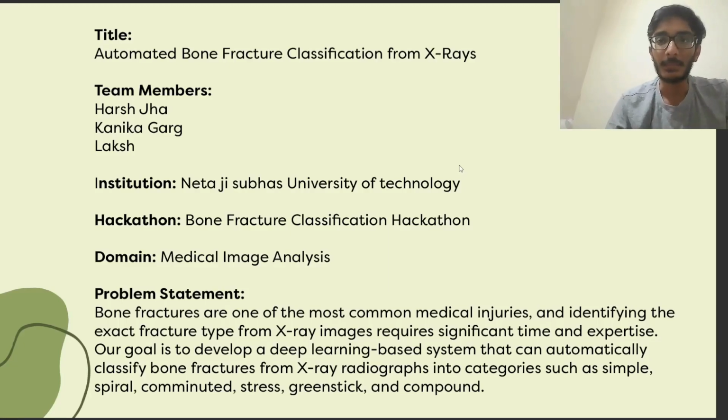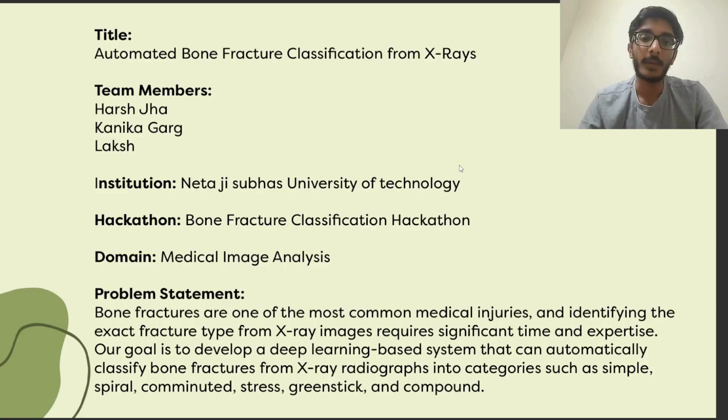Hello everyone. Imagine a situation where a patient arrives at a hospital with a suspected bone fracture. Doctors rely heavily on X-ray images to determine the type of fracture, but analyzing these images requires time and significant expertise. What if an AI system could assist doctors by instantly analyzing X-rays and identifying the fracture type? This is exactly what our project focuses on.